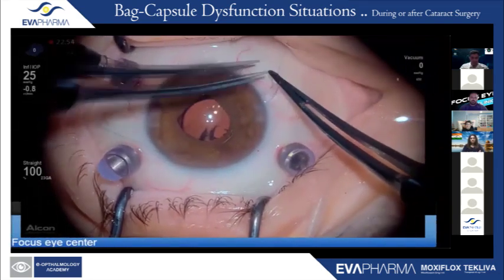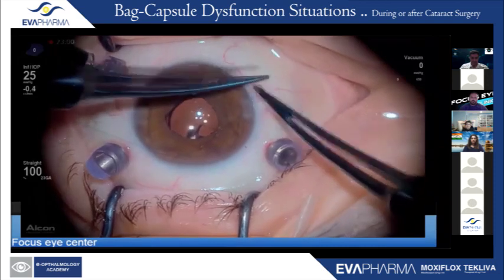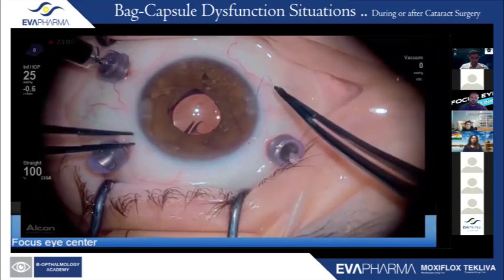This is the one suture. I do it 3, 1, 1, 1. So only the first one needs to be 3 throws.